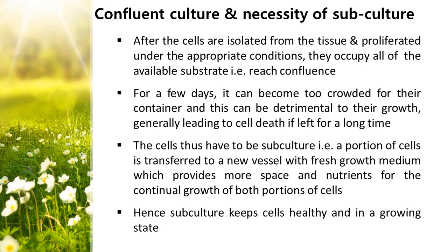The major salts present in Eagle's medium are sodium, potassium, calcium, magnesium, chloride, phosphate, and bicarbonate ions. It also includes glucose and dialyzed serum. So this is an example of a serum-containing medium to promote the growth of animal cells.